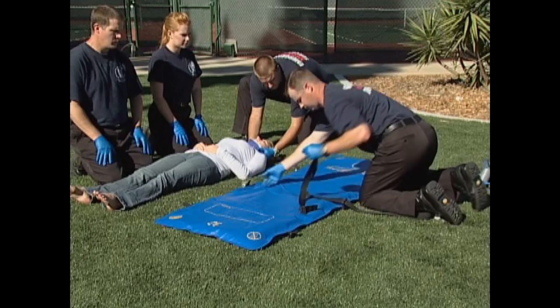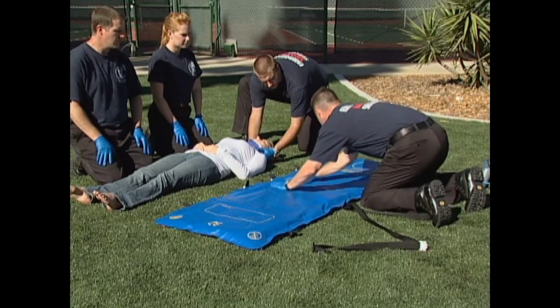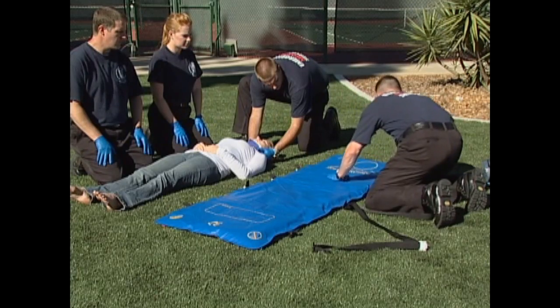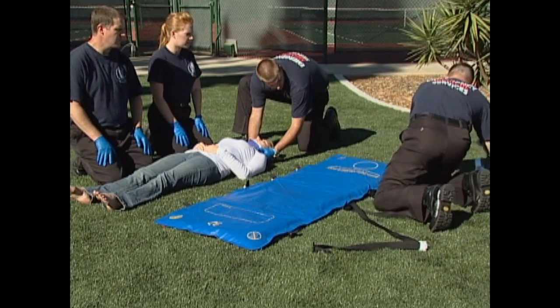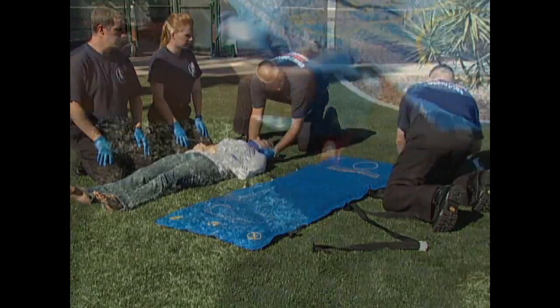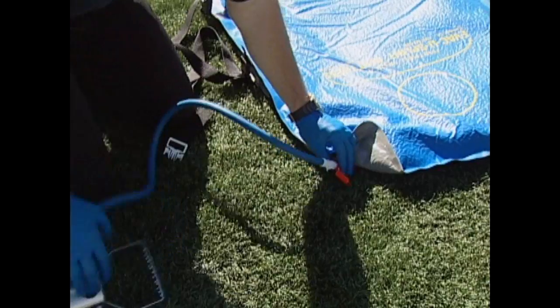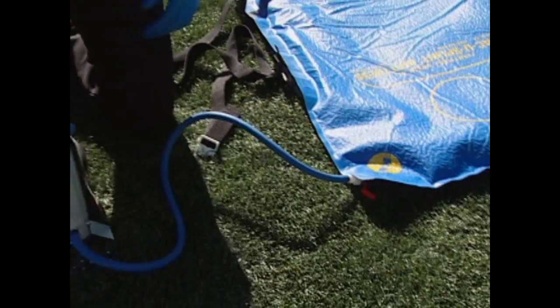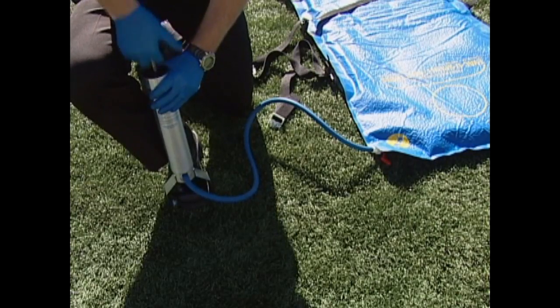Disconnect the patient restraint strap from the mattress, or if desired, disconnect a strap only from the side of the mattress nearest the patient. Manually smooth out the beads to form a level surface. Connect the pump to the mattress by fastening the pump hose connector to the maxi valve on the mattress. The pump can be attached either at the foot end or the head end.